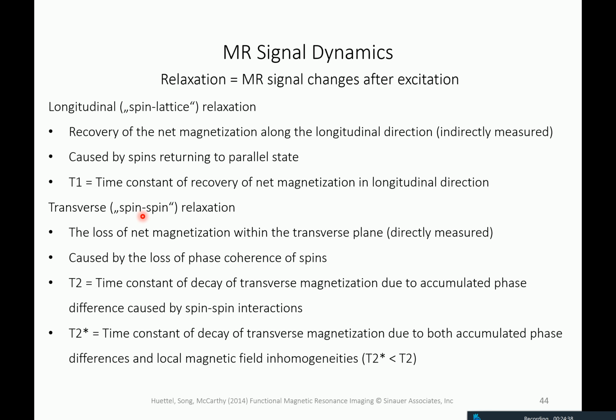Again, we have to postpone the exact, fine-grained difference between T2 star and T2 until a bit later, because one can only explain it if one goes into explaining what a spin echo is, which we can only explain if one has some complex exponentials, blah blah blah. So the longitudinal axis is the z-axis, and xy is the transverse.